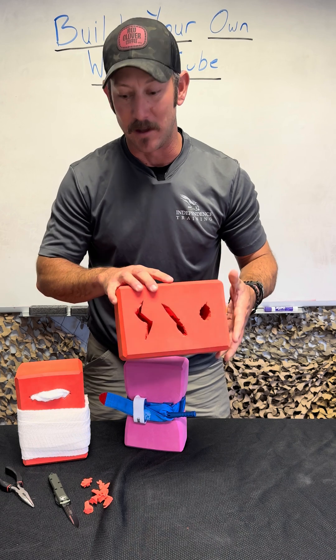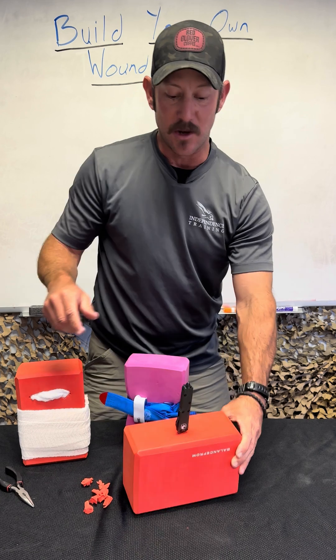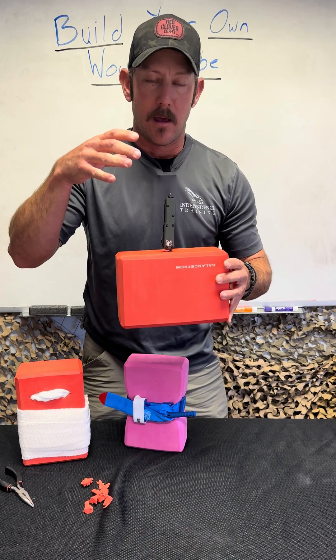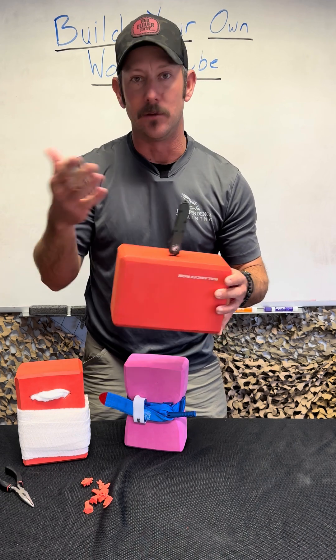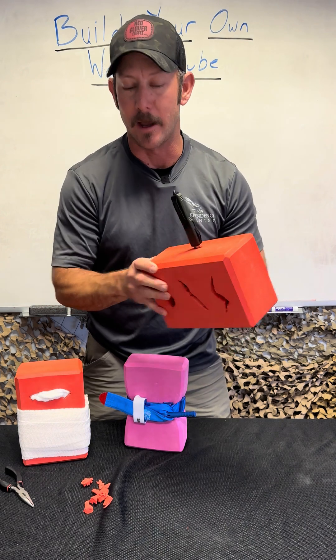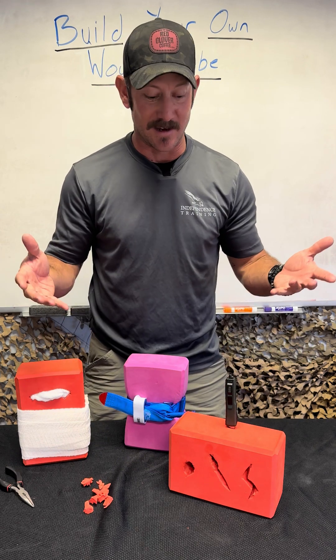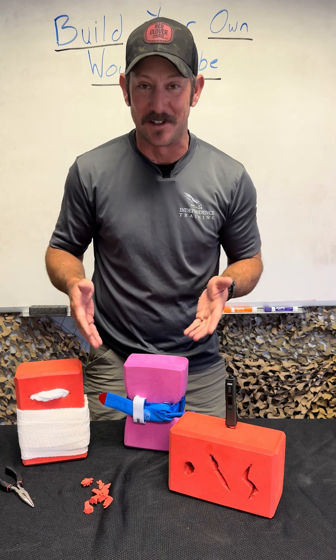Another thing I like to be able to do with these is take something like a knife or other impaling object and stick it into the wound cube. Then you can practice doing impalement stabilization and bandaging using a variety of different objects, including a knife. There are a lot of cool things you can do with these yoga blocks, and at the end of the day it's still a yoga block — if you use them for that purpose, it's still pretty functional.